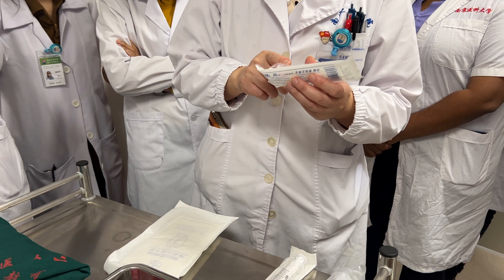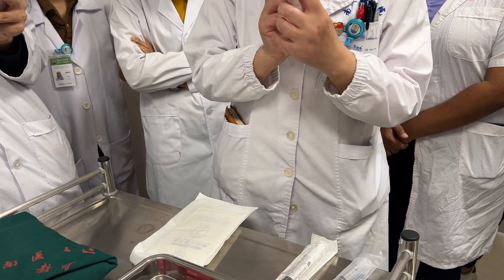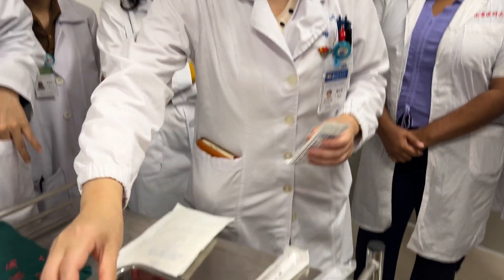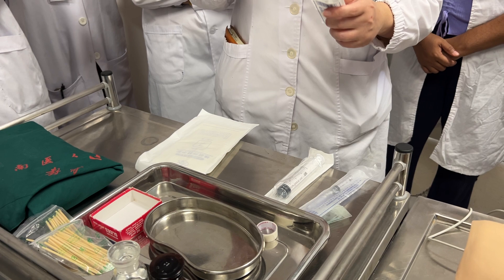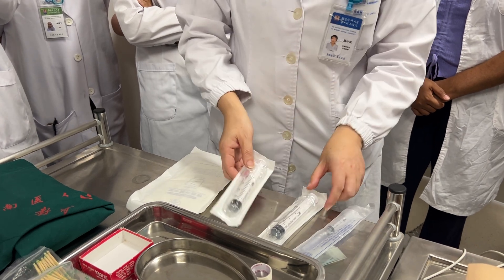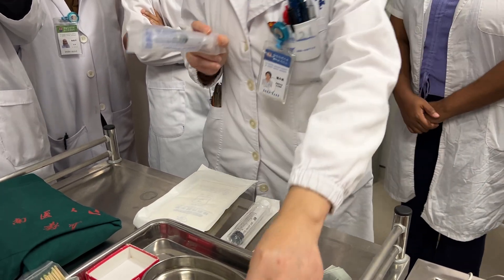For the biopsy and for the chromosome test or gene test, we totally need 10 to 15 milliliters. So we must use heparin to prevent or avoid the coagulation — the clot. This smaller 5-milliliter syringe is for the local anesthetic.